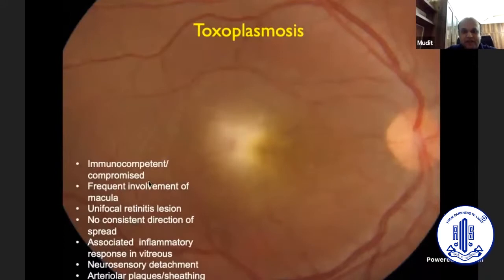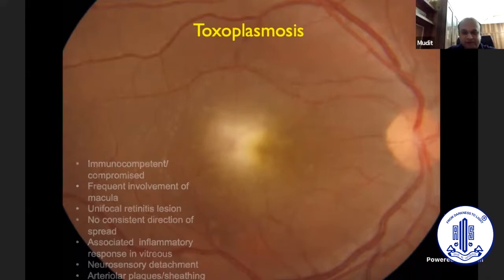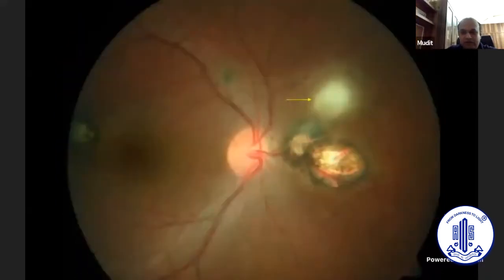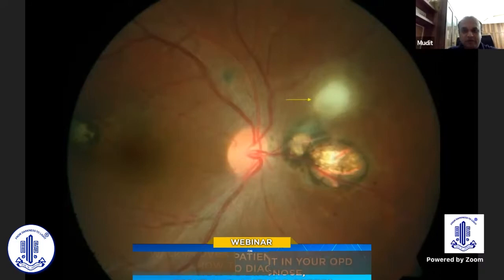Toxoplasma can occur in both immunocompetent and immunocompromised individuals. There is frequent involvement of the macula. It is a unifocal retinitis lesion, and you can have an associated severe inflammatory response in the vitreous. Here you see a scar and an adjacent retinitis lesion — again, a diagnosis becomes pretty straightforward on clinical grounds: toxoplasmosis.